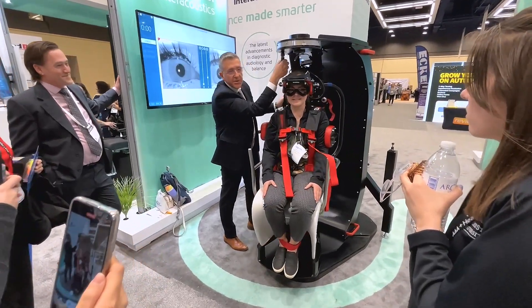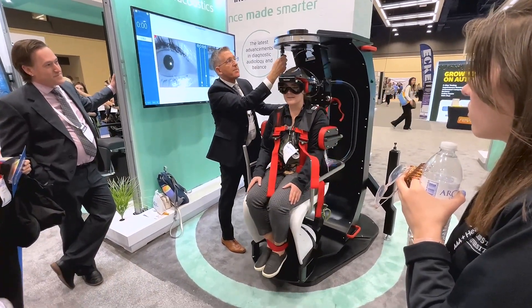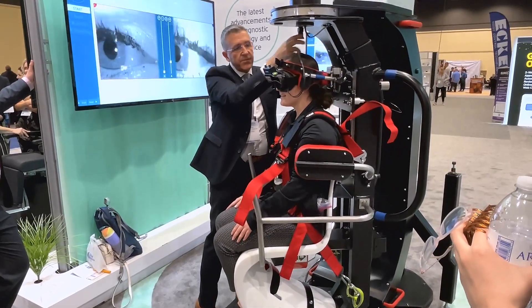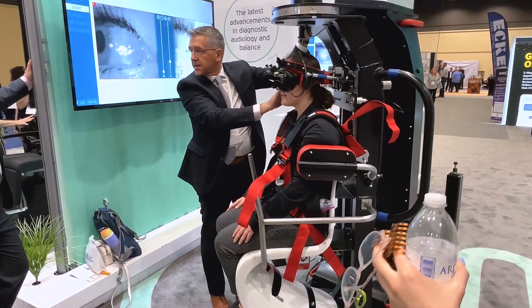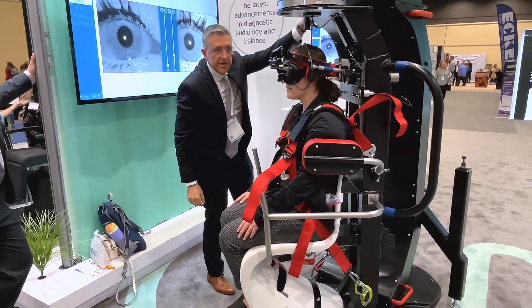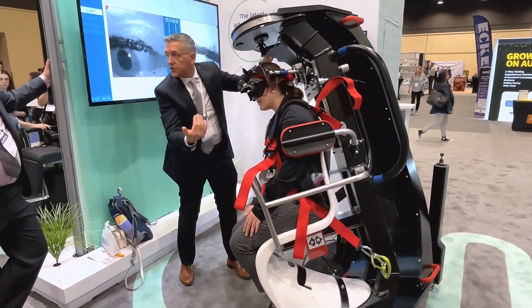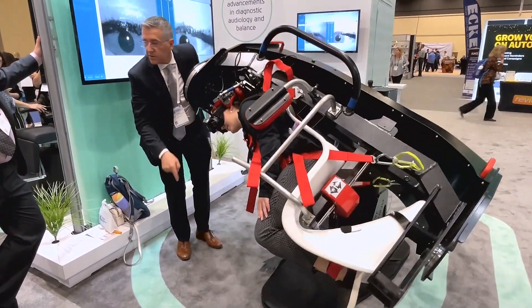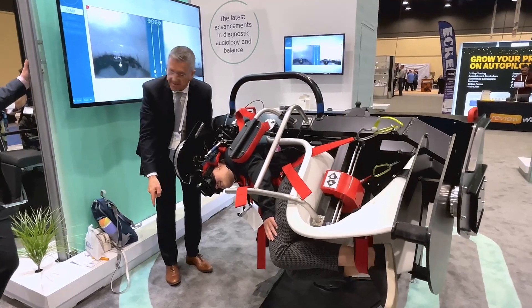We are going to treat the lateral canal. By example, right side — right side lateral canal. We begin to treat at 45 degrees north of the floor, to the involved side.